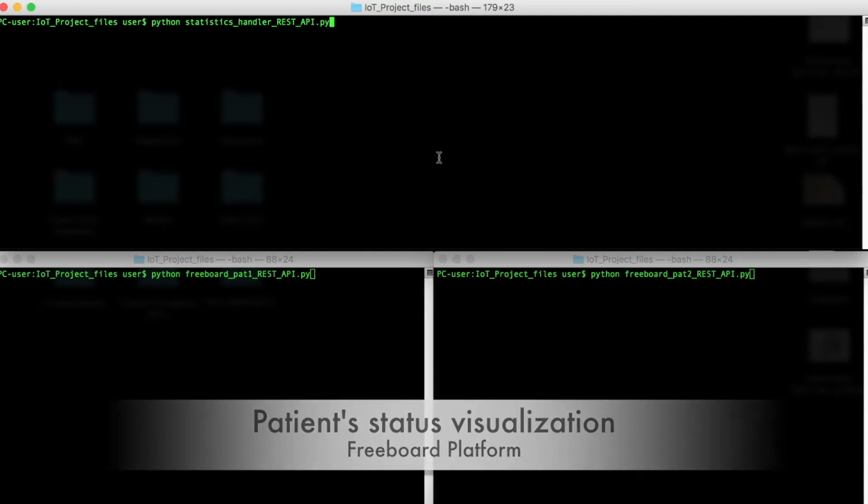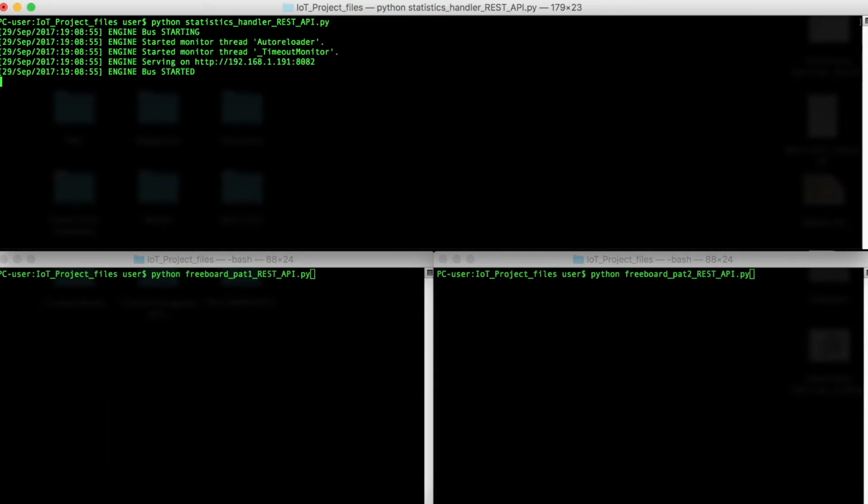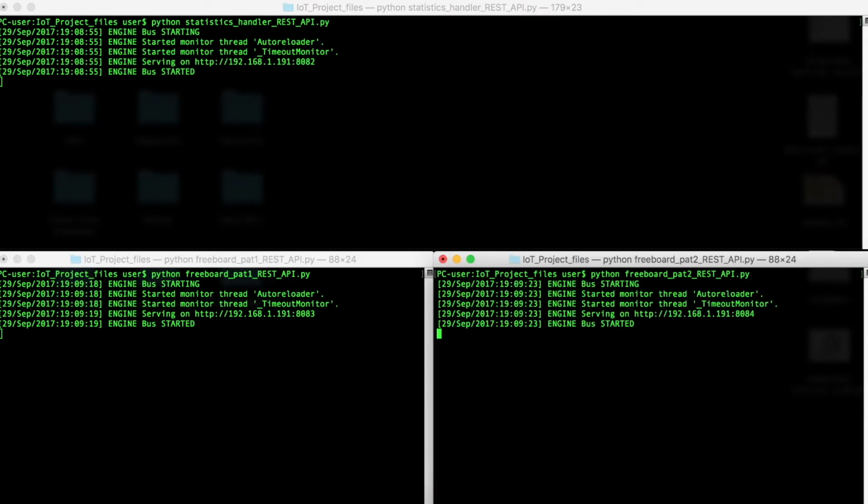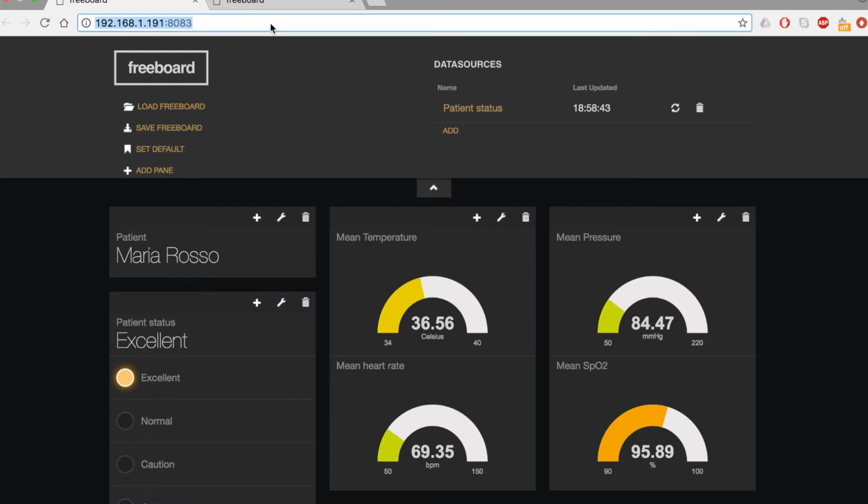Now, we run the Statistics Handler API. It will retrieve data from ThingSpeak platform, according to a defined temporal window, and it will automatically determine patient status, thanks to the use of a series of fuzzy rules. At this point, we can launch simultaneously the Freeboard API for all the patients, 2 in our case. The application will automatically retrieve the patient's status through a GET request we can see from the screen.